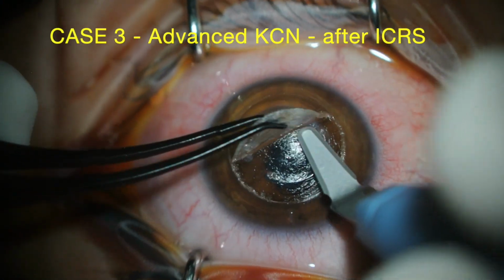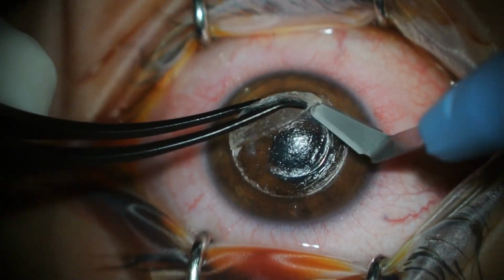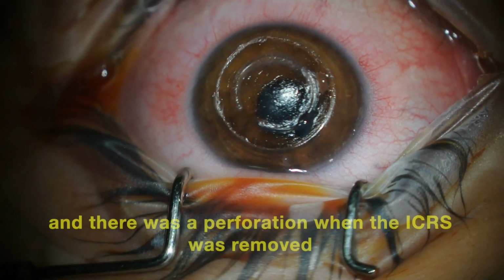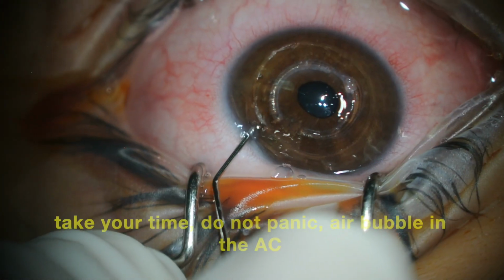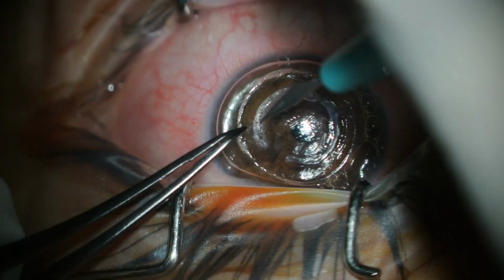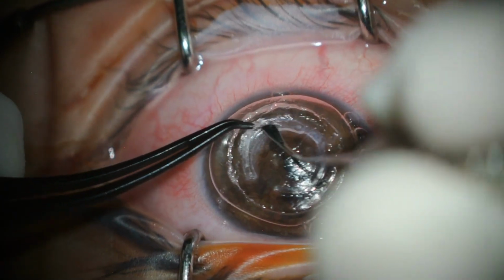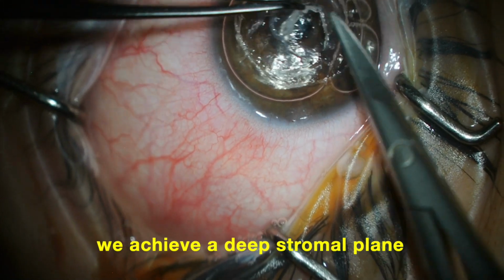Case 3. Advanced keratoconus, after ring segments implantation. The ring is deeply implanted, and there was a perforation when the ring was removed. Take your time, do not panic, air bubble in the anterior chamber. Careful dissection of the second ring. Using the plane of the dissected ring, we achieve a deep stromal plane.